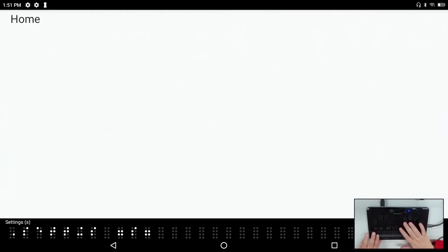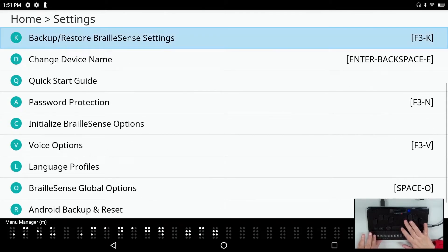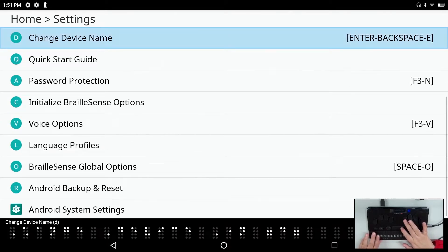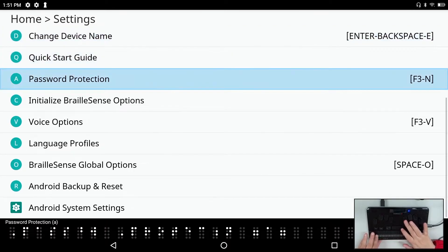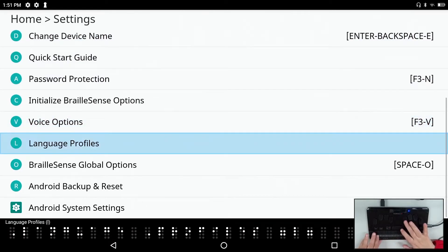Under settings we have set time and date, set up internet, Bluetooth manager, menu manager, backup, restore BrailleSense, change device name, quick start guide, password protection, initialize BrailleSense options, voice options, and language profiles — a new item that allows you to set an unlimited number of profiles for different languages, including system language, Braille code, speech settings, and your voice.